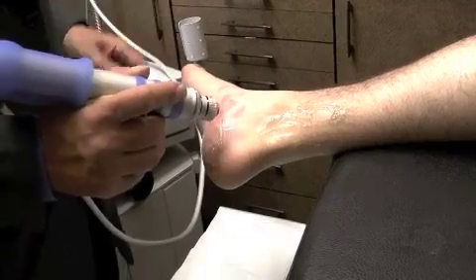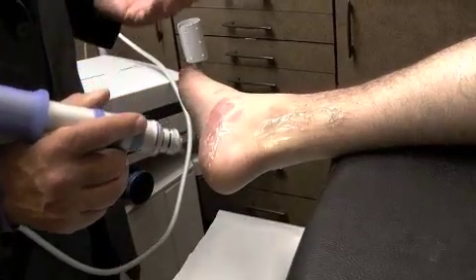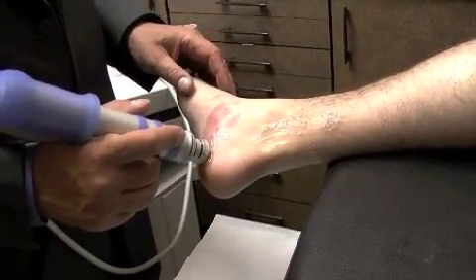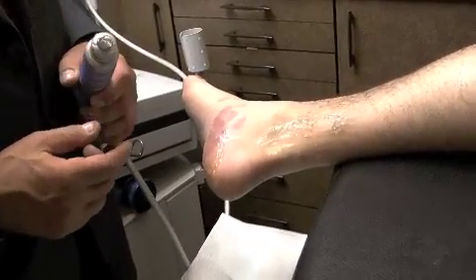So we just turn the dose down on that dial. You can go down to 3 and give a complete treatment at 3 if the athlete can't quite handle it. And they shouldn't feel bad. They can get it the next time. They'll have more confidence and they'll be able to go up to that area. There's really no working parts that have to be dealt with.